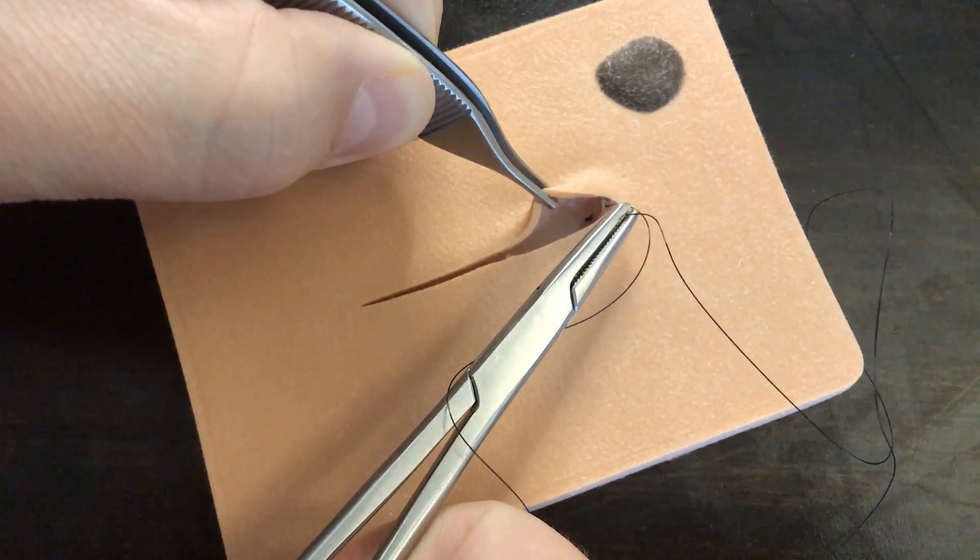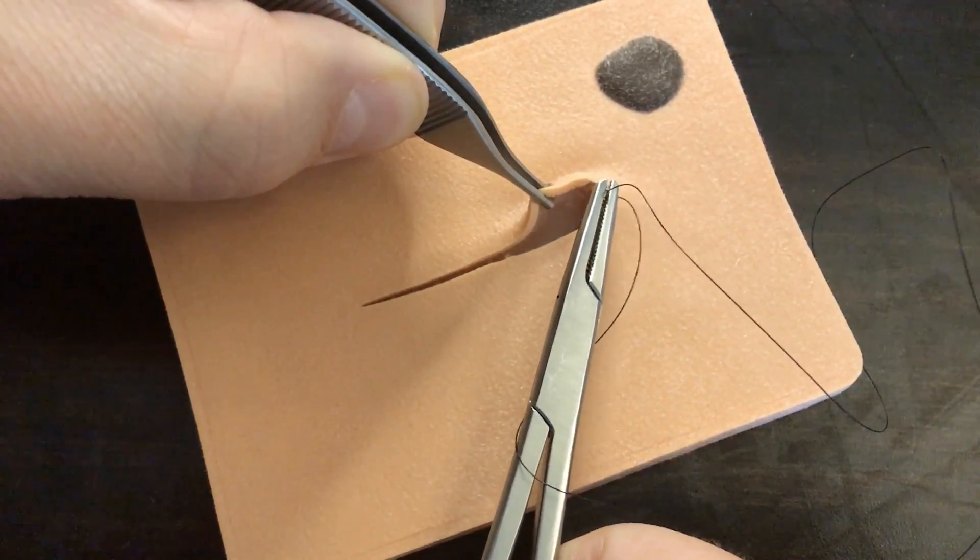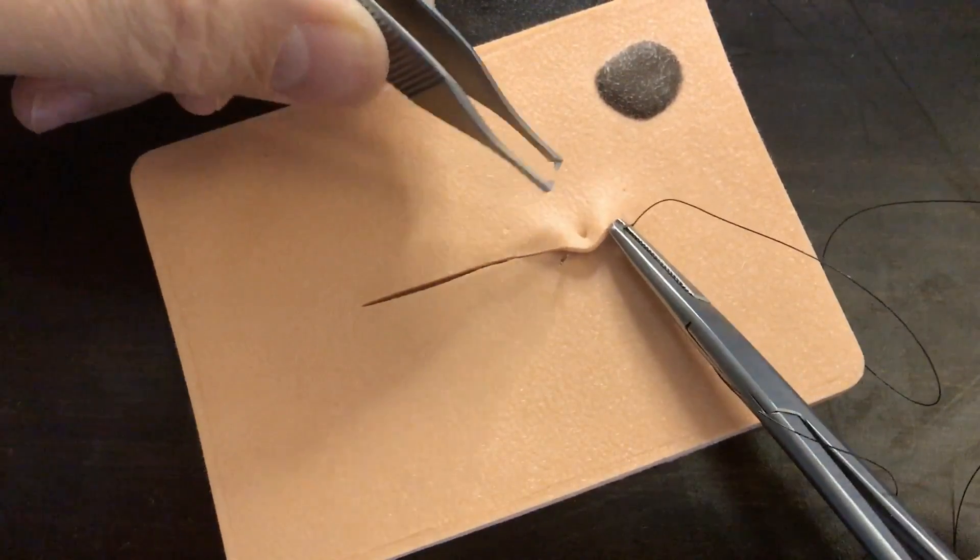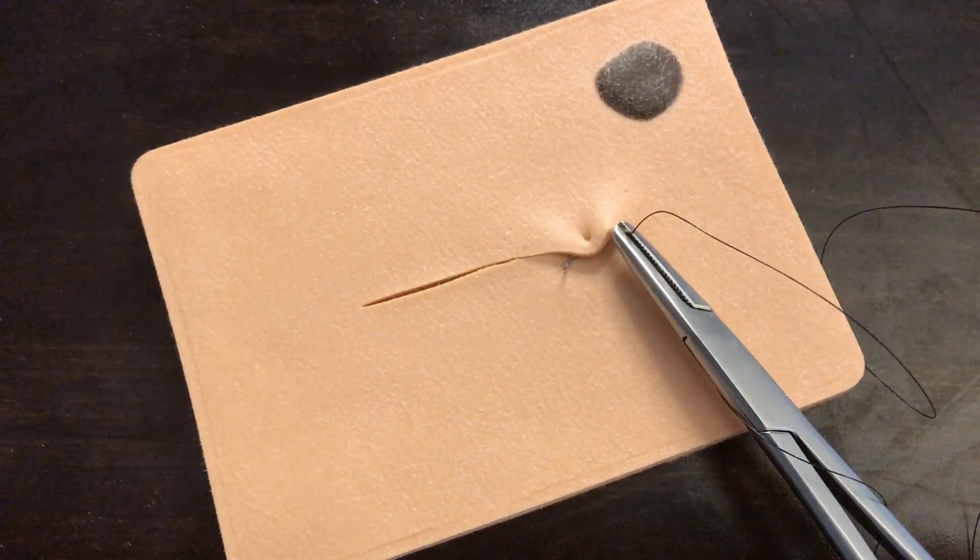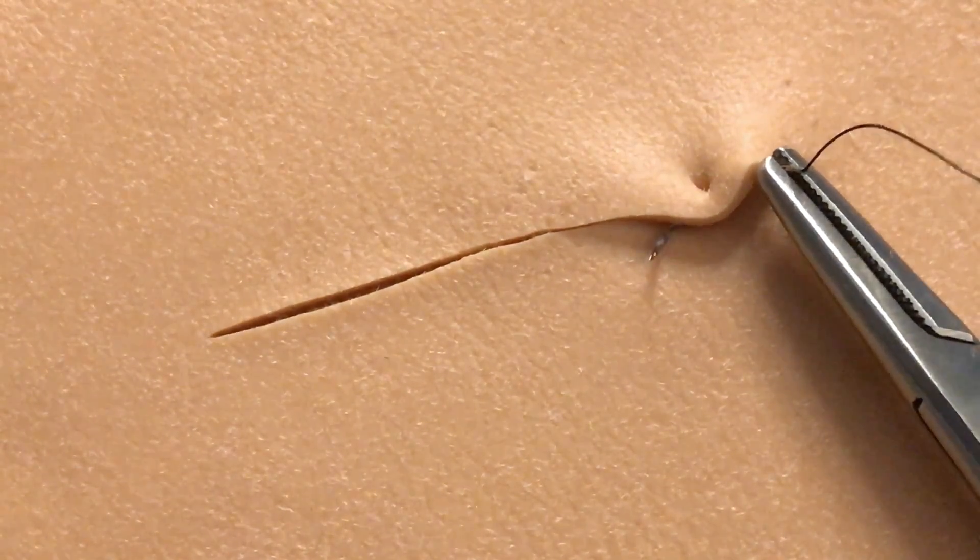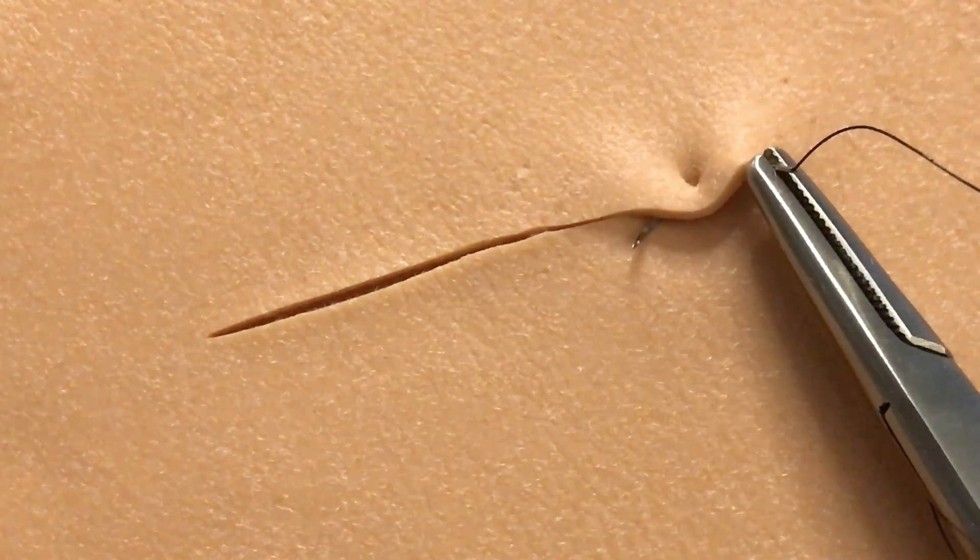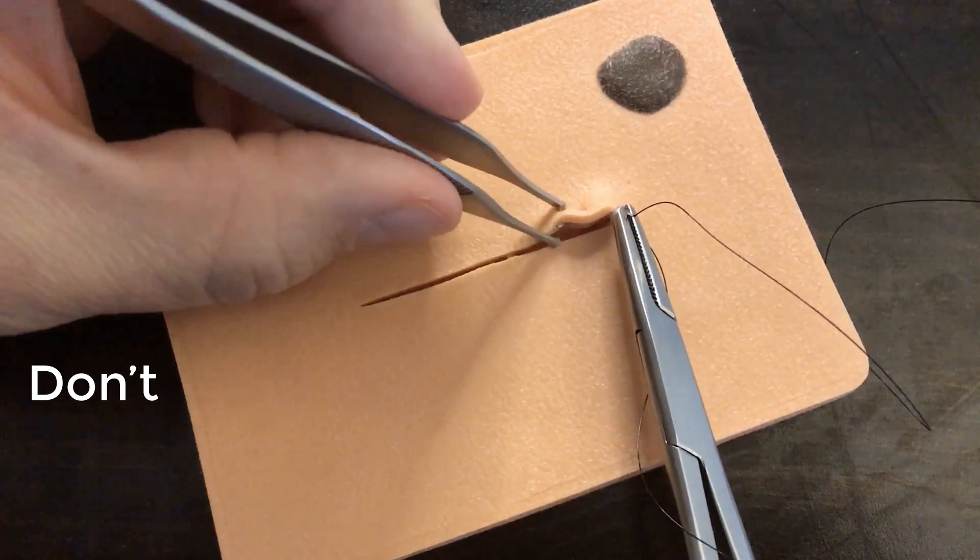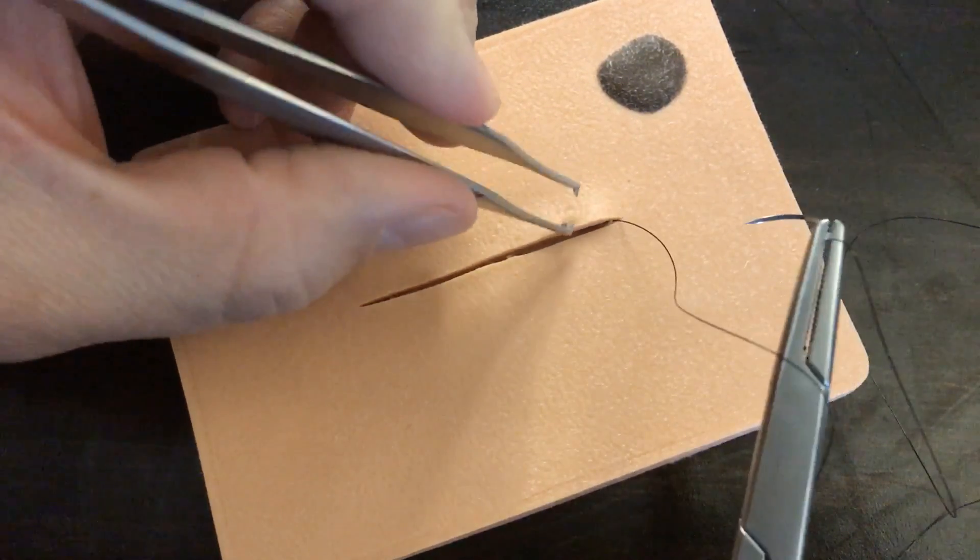So if I'm doing this method and I accidentally, I'm entering the skin, then this horizontal plane, and I poke through a little bit without realizing it, and then I come back this direction. Now notice if I pulled that through, I've got that little dimple there. Let me zoom in. That's my needle, which means as I pull the suture through, the suture is going to be exposed in that spot. So don't do that. I'm going to pull this out and start over.